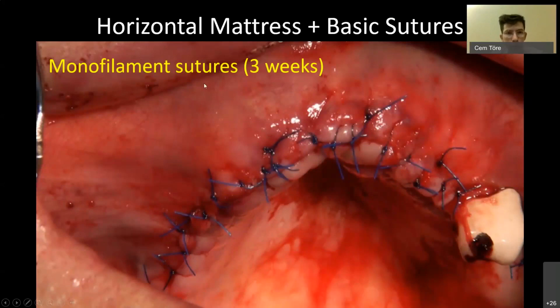We use monofilament sutures. Our best bets for this are nylon, the one you see here, which goes by the trade name Cerelon. And the other one is Teflon sutures, the white sutures you can come across in textbooks, especially on augmentation subjects. Those are PTFE sutures, Teflon sutures. Both are preferable over silk or Vicryl. We definitely don't want resorbable Vicryl, but silk also tends to collect food and thus bacteria. We don't want that, to prevent infection. So monofilament sutures whenever you can.